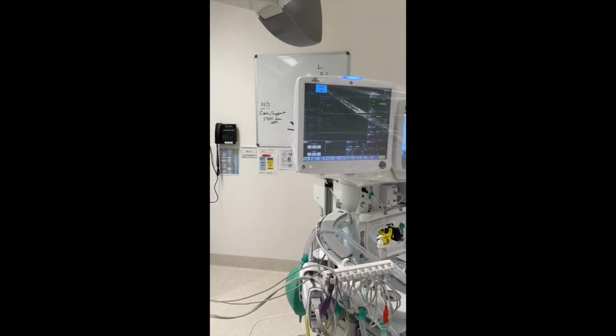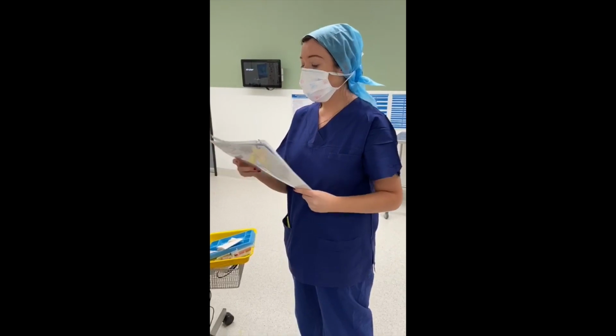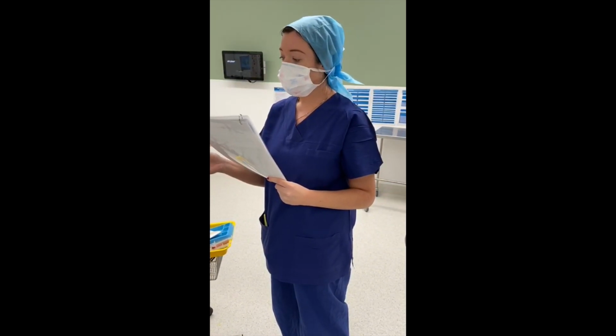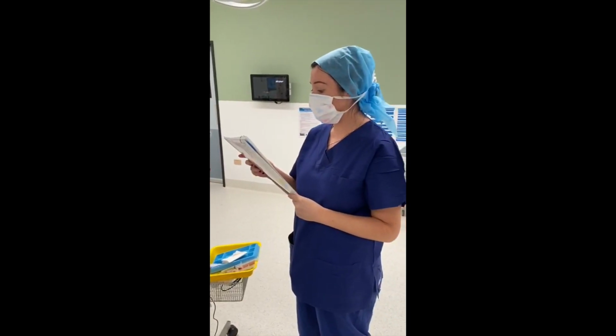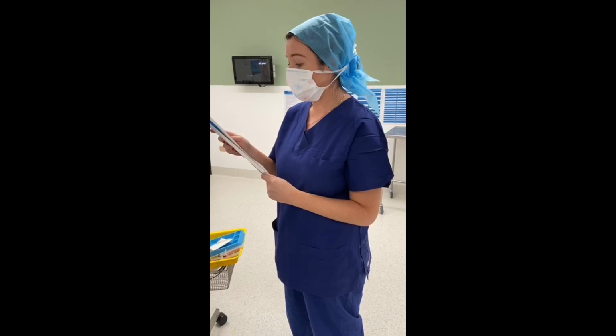During this time, we're going to quickly review the key DOVES steps once again. The sequence will be drugs. I will be giving fentanyl, ketamine, suxamethonium. Fasciculations will be observed and rocuronium will be given. I will then turn off the oxygen by turning the lever of doom and declare oxygen off. Please remember, oxygen off before mask off.